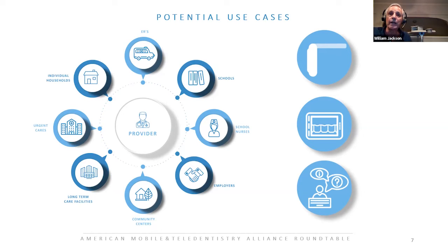Once again, saving that plan a significant amount of money, keeping people out of the emergency room, catching disease in its earliest stages, dealing with chronic healthcare patients, diabetic patients, and so forth, being able to give them dental care on the spot. So again, I don't want to spend a whole lot of time on it, but there is a whole level of consumer use too that we've talked about.